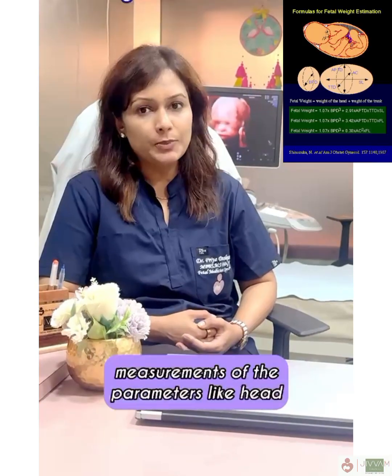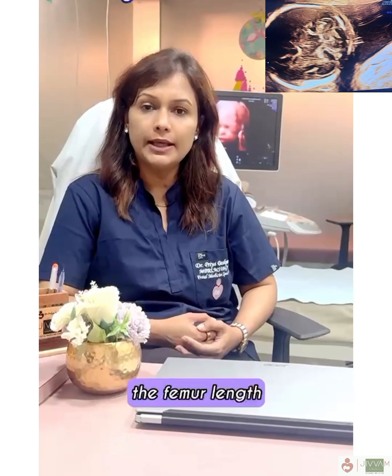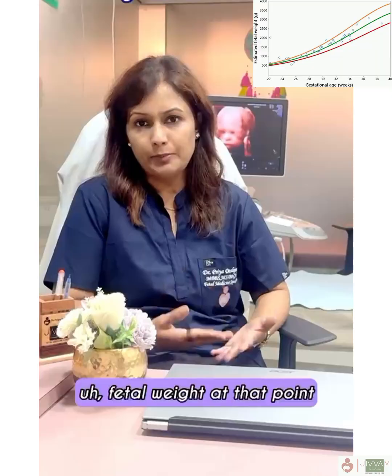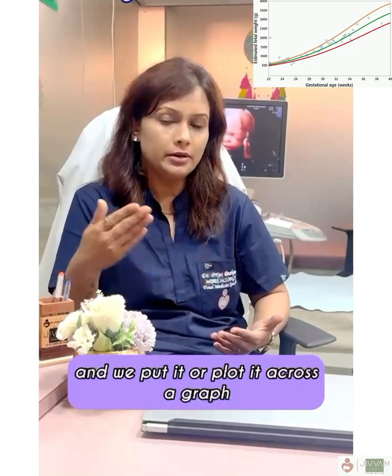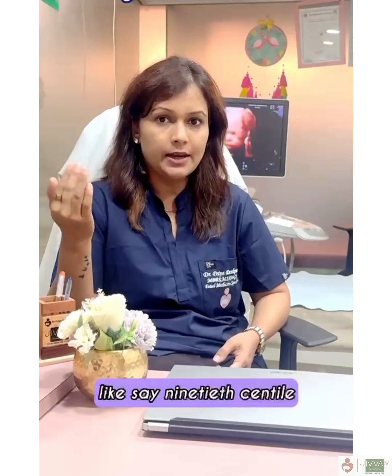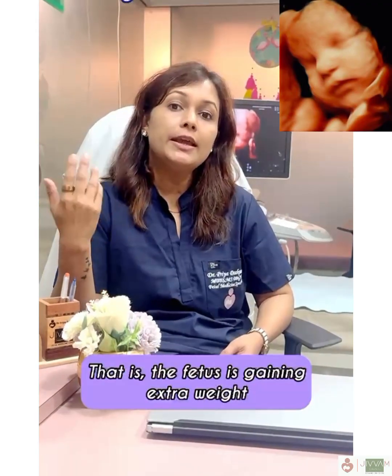So we take measurements of parameters like head circumference, abdominal circumference, and the femur length, and that goes into a formula, an auto calculation, and then we get an estimation of the fetal weight at that point. That gives us an assessment, and we plot it across a graph. Now, if it is on the 50th centile, then it is normal. If it is on the higher centile, like say 90th or 95th centile, then the growth is accelerated. That is, the fetus is gaining extra weight.